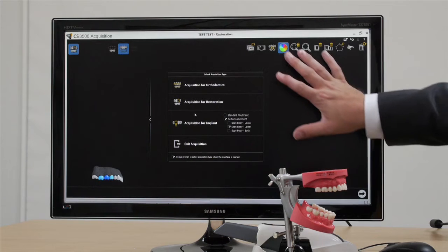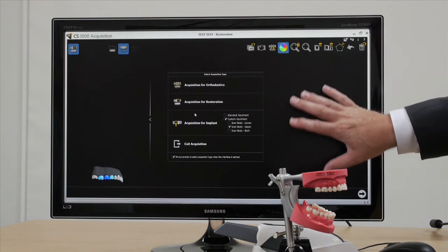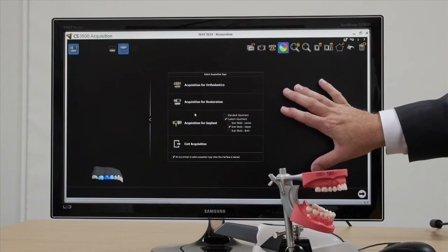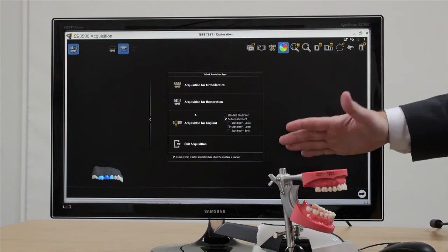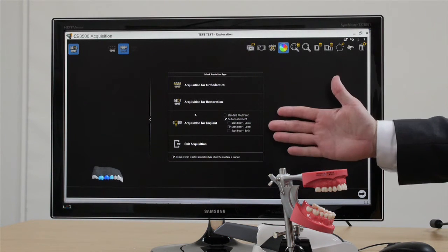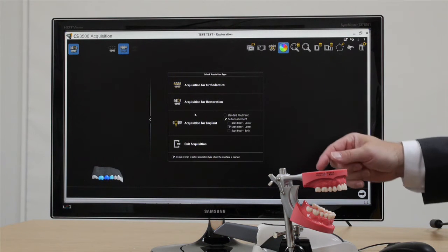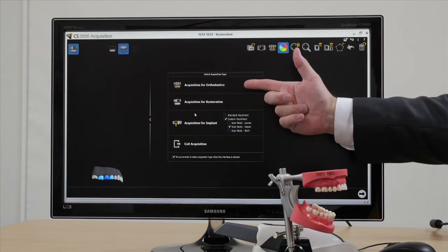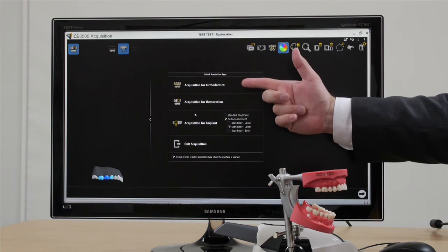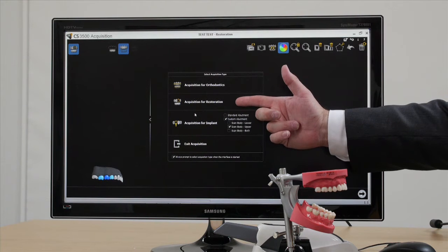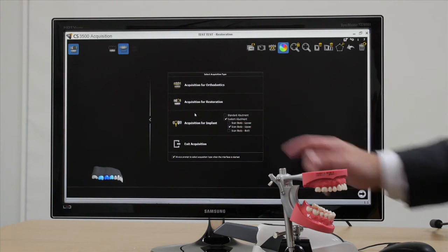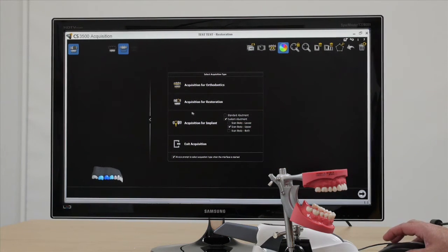Okay, so here's our acquisition software screen. What we're going to do now is step you through how to scan using the 3500. So firstly, choose what you want your scan for. Is it orthodontics? Is it restorative? Or is it implant? So click the relevant button.